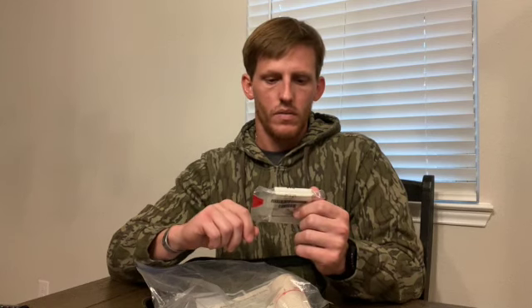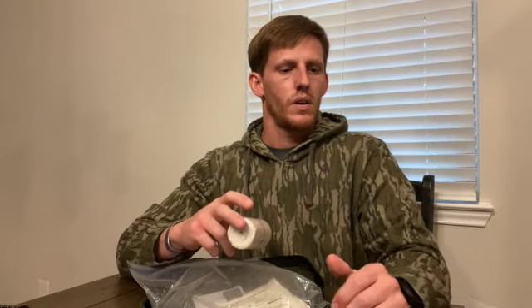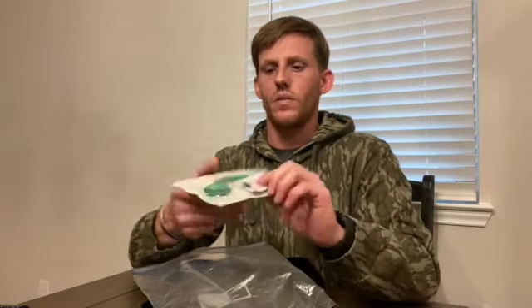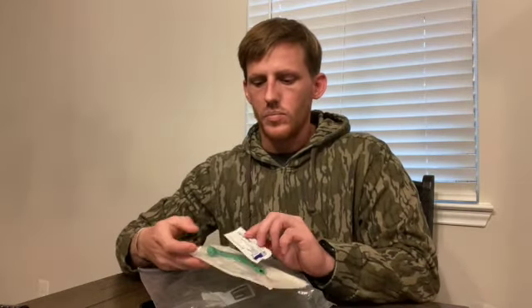This is 4.5 yards. Next, you got an ace wrap. This would be for after you get your pressure dressing on — you can wrap it up with this ace wrap and help keep everything all together without worrying about it coming undone. Got a nasal pharyngeal airway with some lube. This is a size 28, which is going to be your average size for your average adult male. In this kit, that's what I keep. I have some smaller ones and some bigger ones in other places, but in this kit I just try to save on room, so I keep a 28 in there.